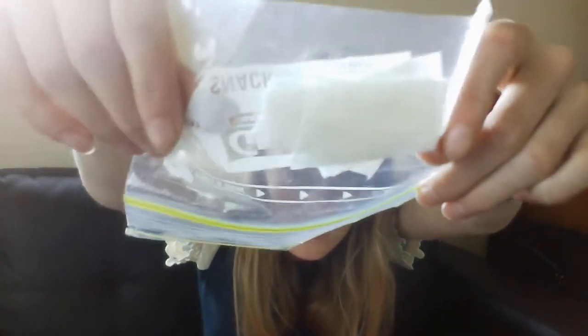So next, there is a wee compartment over that, so if you flip that bit over, this is this compartment. It's extremely messy, I'm sorry, but I'll just go through and lift everything up and explain it. So this here is full of little baby wipes that I have cut up. Now I use Treasure's baby wipes. I use the non-alcohol and fragrance-free baby wipes, and I use those because when I test my bloods, I want to make sure my fingers are really clean, and if I don't have the facilities to wipe my fingers clean or wash my fingers clean, then I need to be able to wipe them.